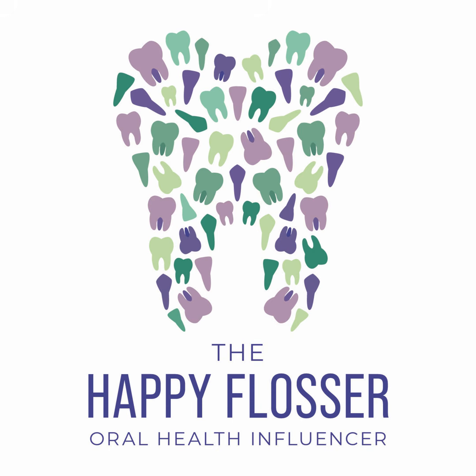When you take an image of a patient, maybe you're doing the posterior bitewing, the radiation comes through the PID, through the air, through the cheek, through the bone and metal, and onto the sensor. Now think about what that image shows up on the screen as.